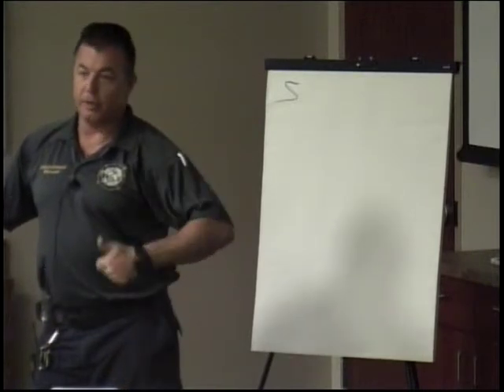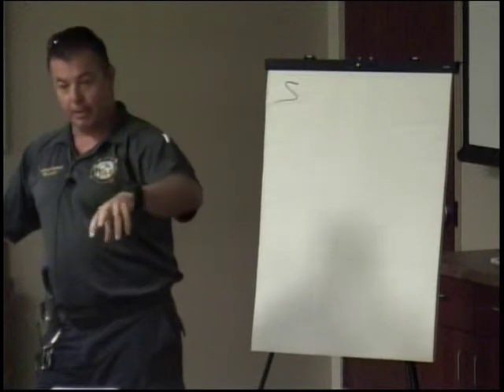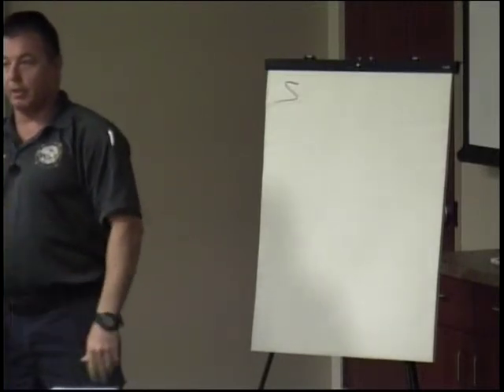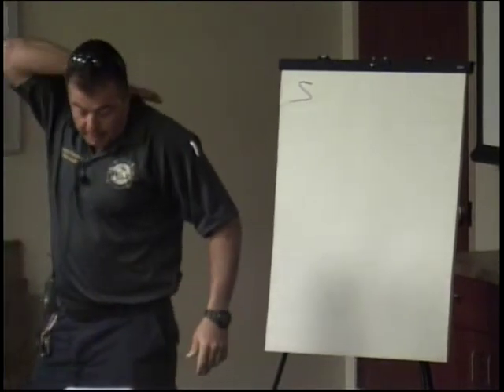Obviously the number one reason we use it is to monitor ventilation. You can use the number itself, you can use the trends, and some of the numbers and the trends can help warn you of things to come, which is a good thing.